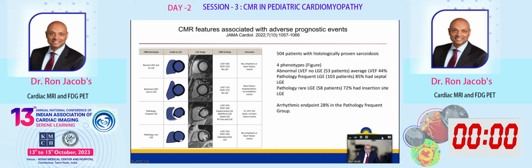What about prognosis? And this has been well established. This paper was published in 2022. It's 504 patients, split into pathology rare and pathology frequent patients. Patients with abnormal LVEF but no LGE generally tended to do well, as opposed to patients with LGE, regardless of LVEF. And that's a consistent trend in this population: if you have normal LVEF and no LGE, you have no arrhythmic events or heart failure.